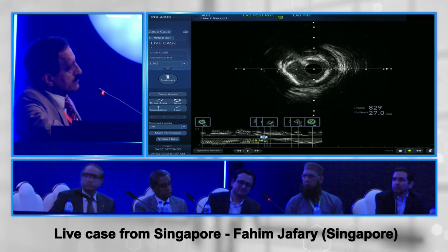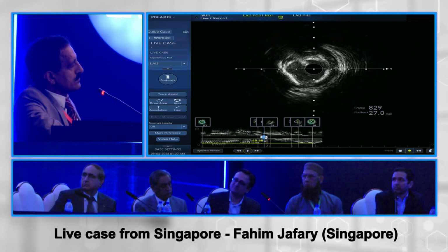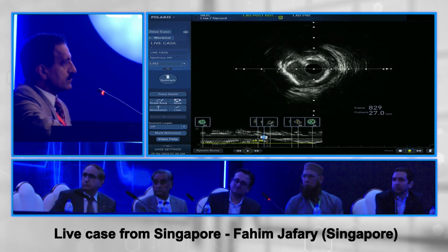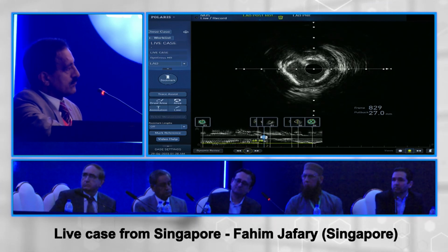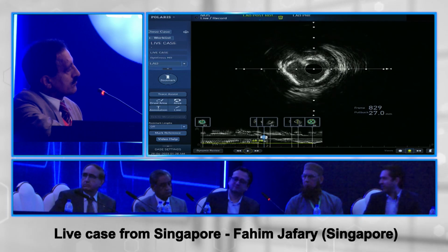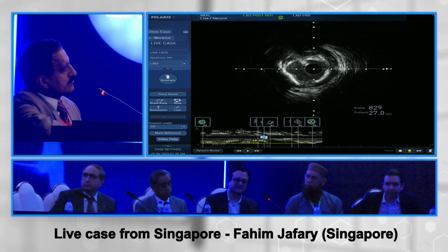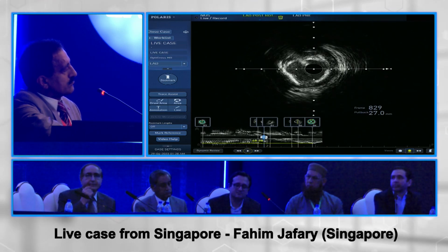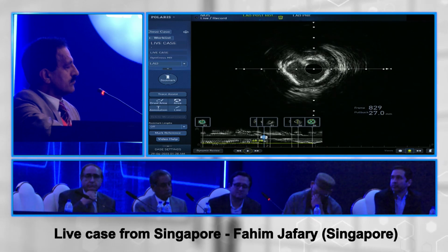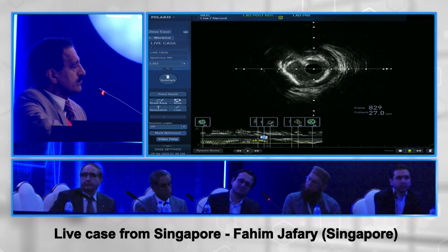And of course, at this point, the patient is intubated, and just for those who've just joined in, the patient, after sedation, started retaining CO2 and became agitated. It wasn't a coronary-related issue. His wedge pressure was actually pretty unremarkable, 18 or something. And so now he's intubated, and we then decided that, okay, after some calcium cracks, let's go ahead and dilate this with an NC balloon. I'd be curious to know who would use IVL at this point.